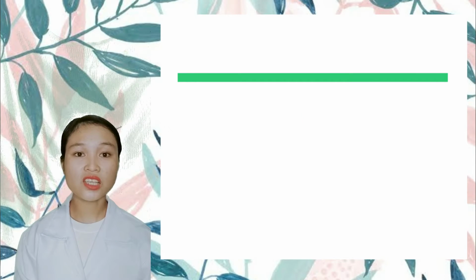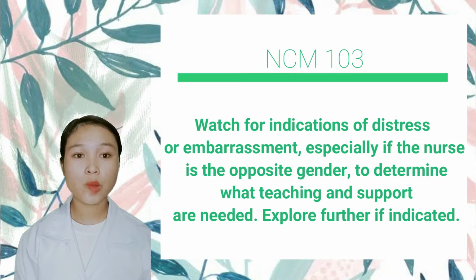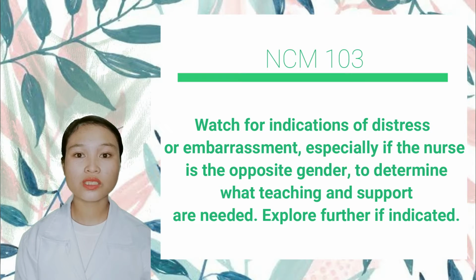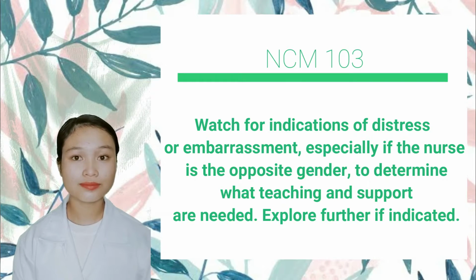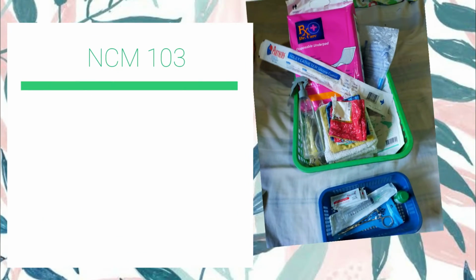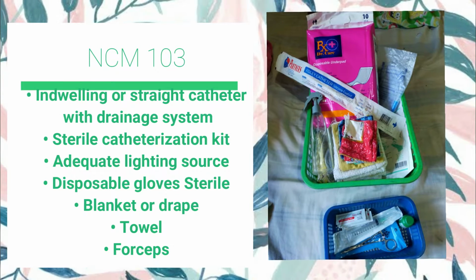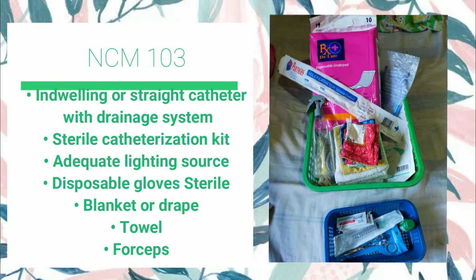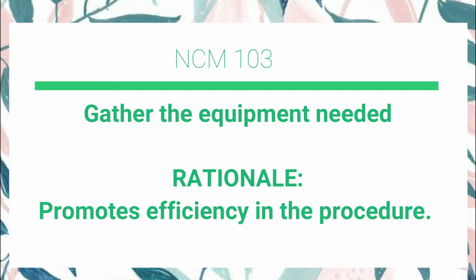Watch for indications of distress or embarrassment, especially if the nurse is of the opposite gender. Determine what teaching and support are needed. Explore further if indicated. Gather the equipment needed. It promotes efficiency in the procedure.